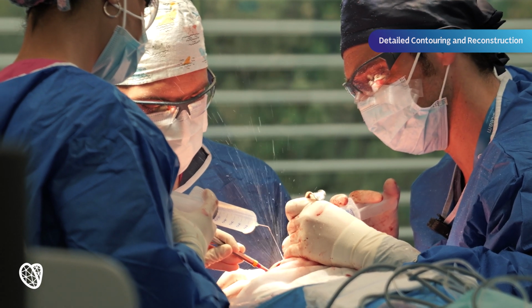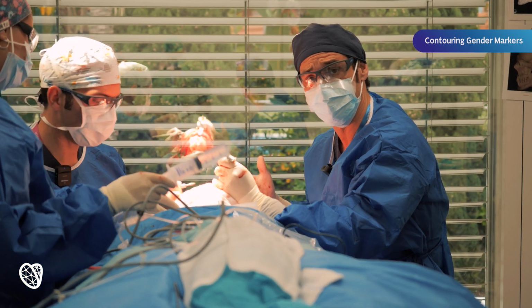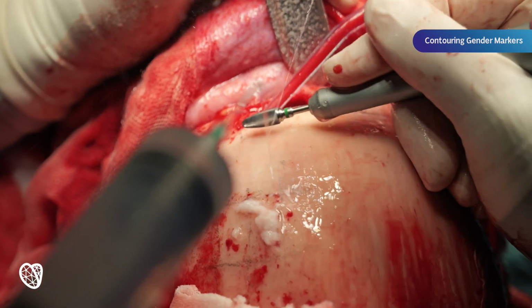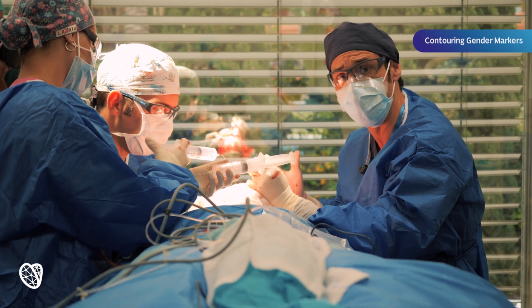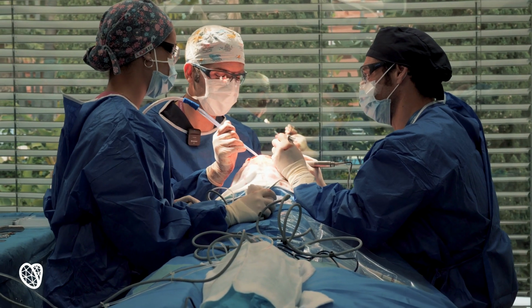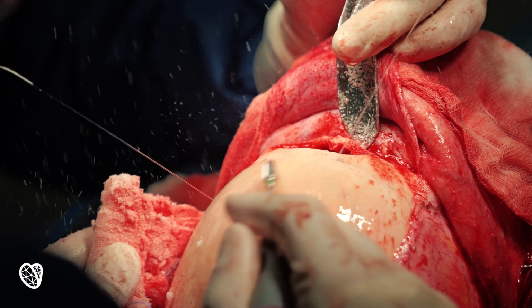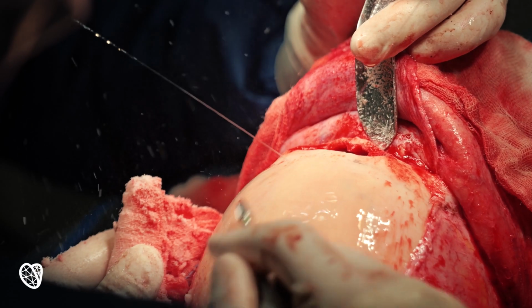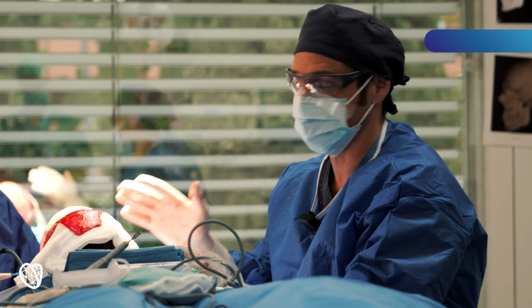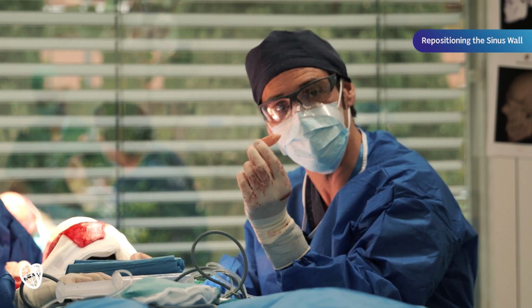During this new surgical step, we are shaving or burring the bone surface around the frontal sinus that allows us to contour, to soften, to round the whole forehead surface. Well, the bone shaving is done. Here we have the anterior wall of the frontal sinus.